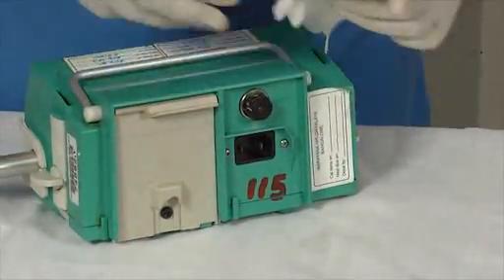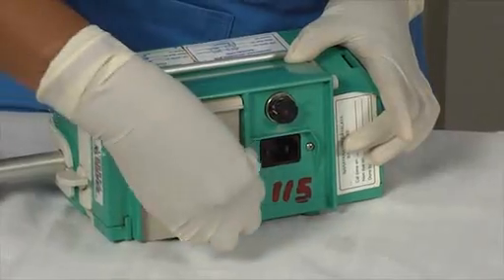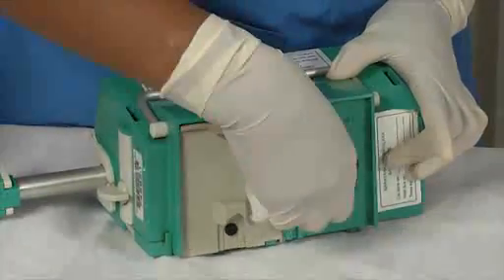Now clean the back of the pump. As you can see, the pump is cleaned and it is ready for use.